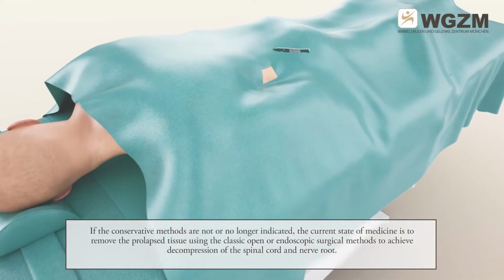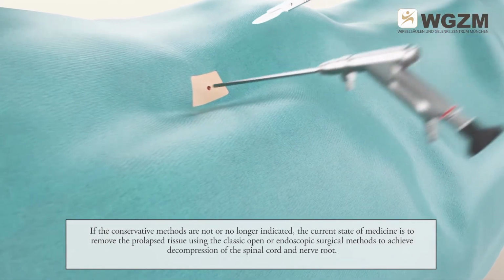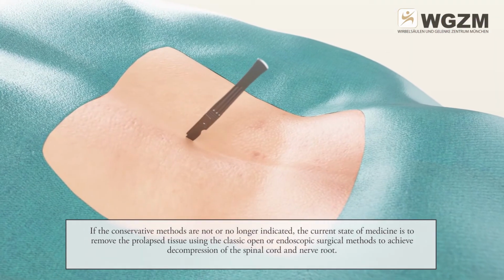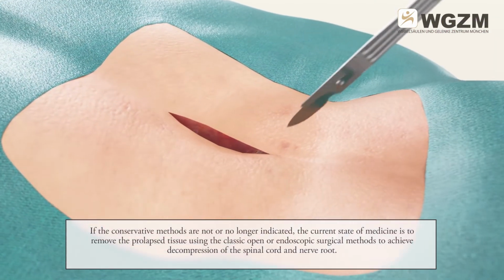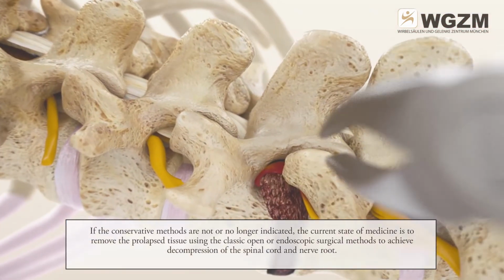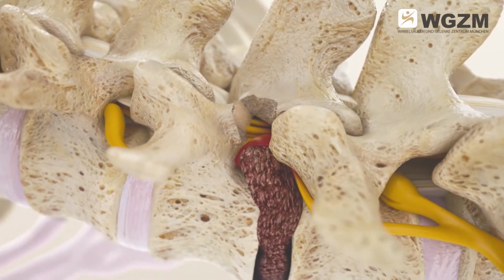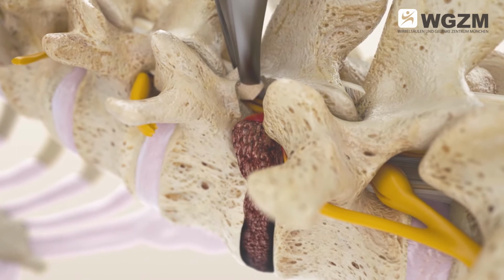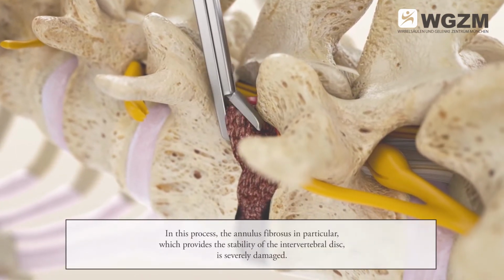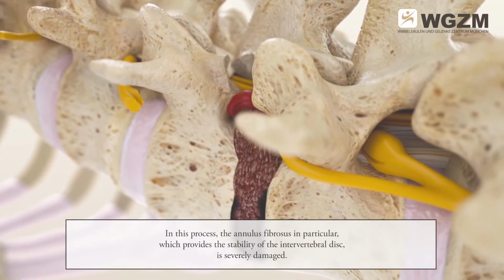If the conservative methods are not, or no longer indicated, the current state of medicine is to remove the prolapsed tissue, using the classic open or endoscopic surgical methods, to achieve decompression of the spinal cord and nerve root. In this process, the annulus fibrosus, which provides the stability of the intervertebral disc, is severely damaged.